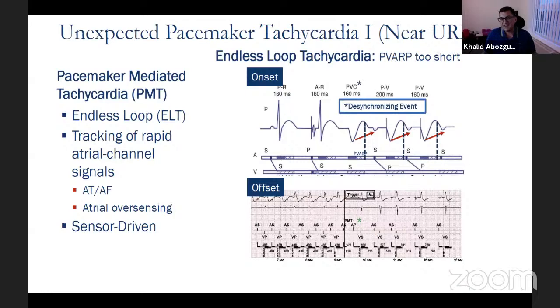It's very unlikely to cause any trouble. It depends on the radiographer's comfort zone whether they want to do it or not. Even with non-MRI compatible leads, Johns Hopkins has thousands of patients and did studies, there's this guy, Irani. They have tons of patients that showed it's safe, with little risk of problems. So I think MRI compatibility is more of a marketing thing rather than anything else.